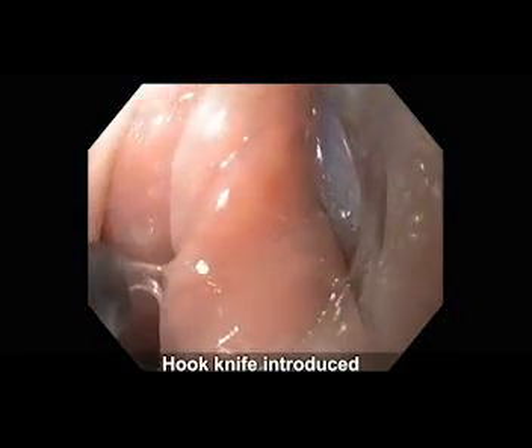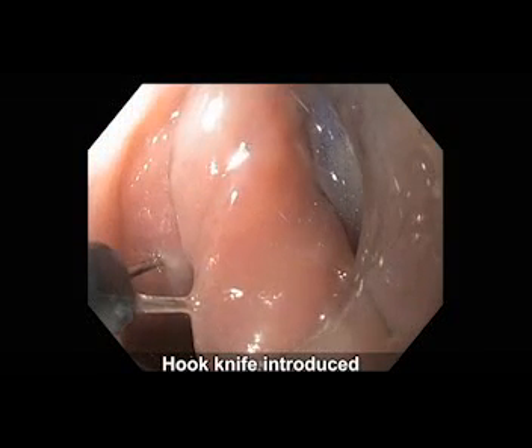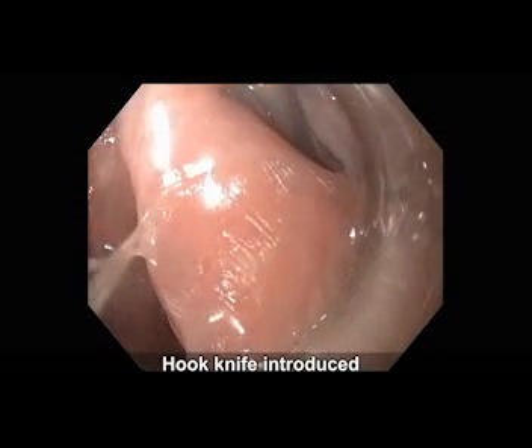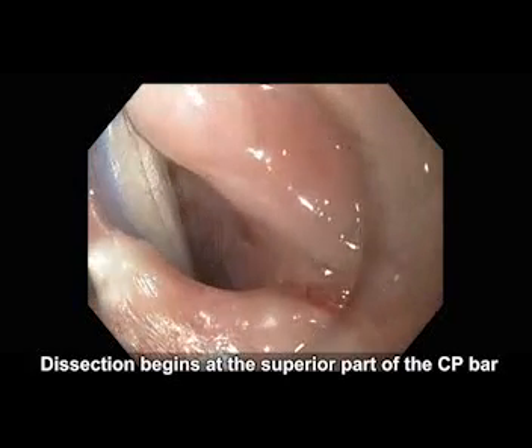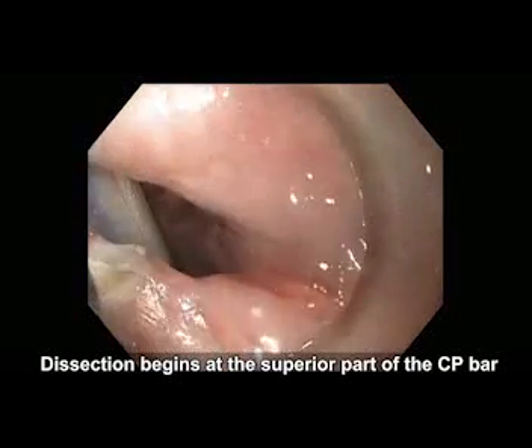The hook knife was then introduced and the myotomy could be started. The dissection of the septum is performed beginning at the superior part of the cricopharyngeal bar.